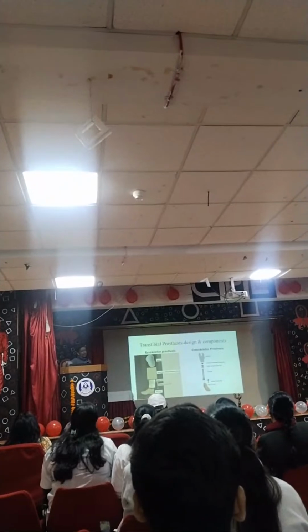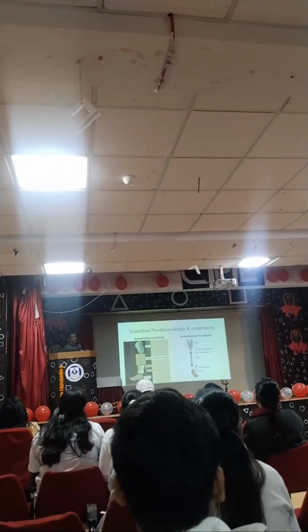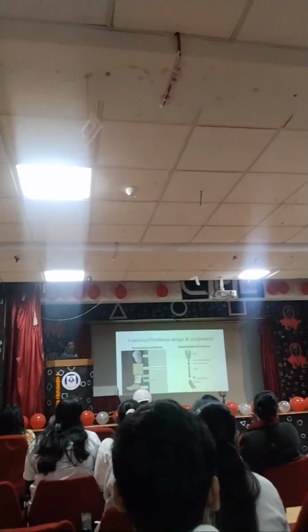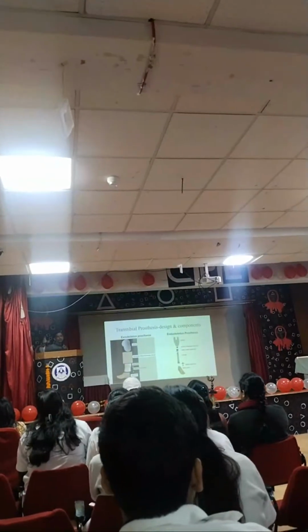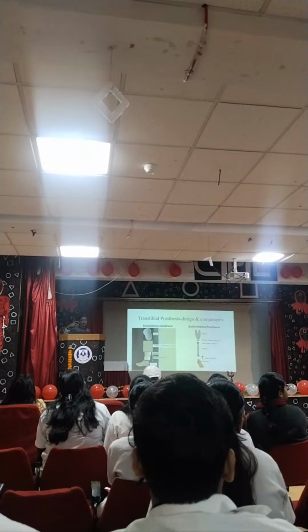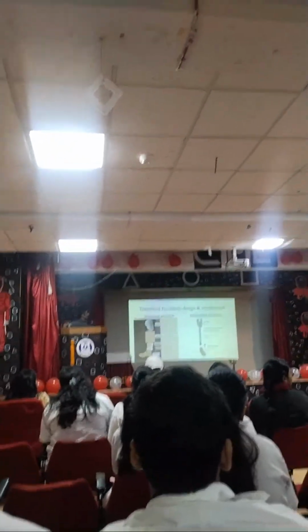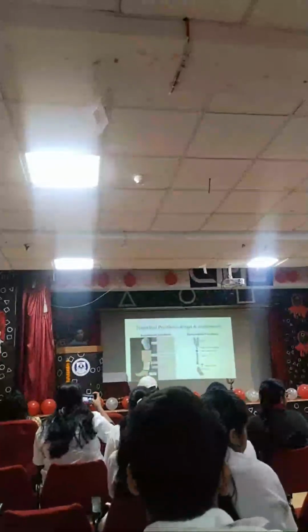Modular means it has got different parts which are modular. They are adjustable compared to the exoskeleton, which is non-adjustable. Once you fix a socket into the socket block, socket mounting we call, once you mount it, you cannot change the flexion and adduction angles. But in the case of endoskeleton, this is possible, and therefore they are modular.